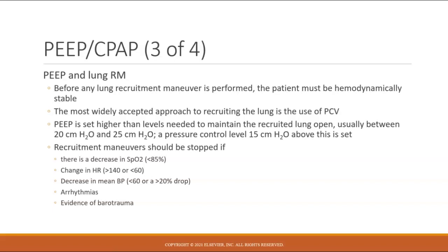If at any point during that recruitment maneuver I see a decrease in my SpO2, a change in my heart rate, a decrease in my blood pressure, any arrhythmias, or any other signs that my patient is in distress or having barotrauma, I need to stop that recruitment maneuver right then. Your book does talk about recruitment maneuvers and gives recommendations for how they should be performed. That is in a box on the top of 1094, the recruitment maneuver step by step.